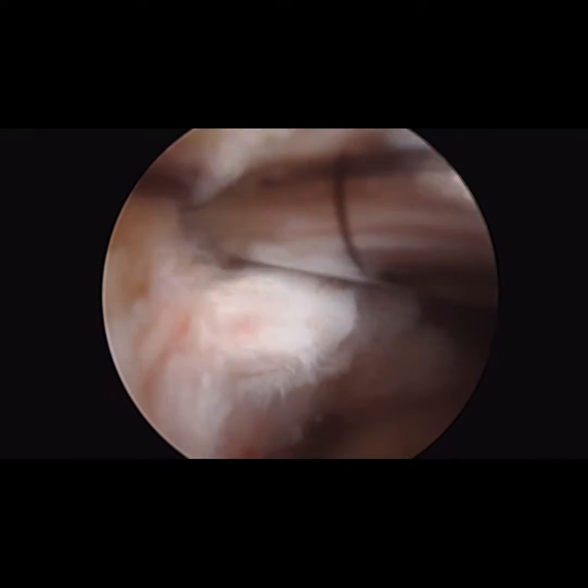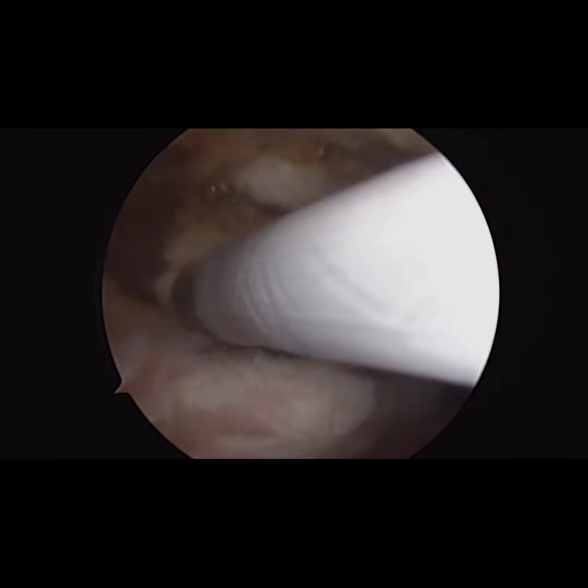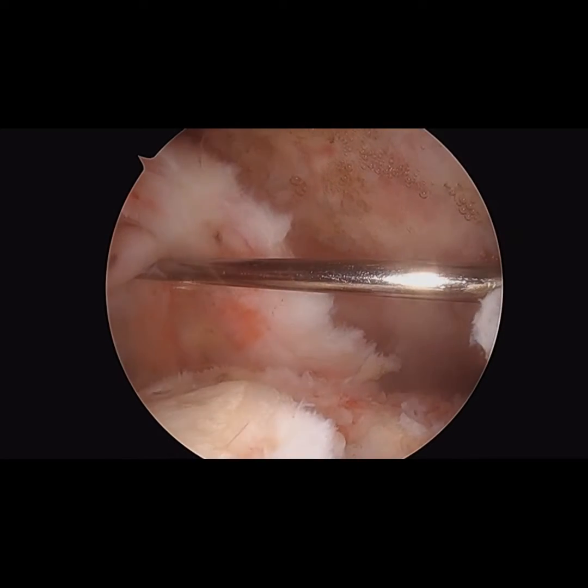A generalized debridement was then performed to remove soft tissue and clear a space above the remaining rotator cuff, such that the InSpace balloon can be placed.